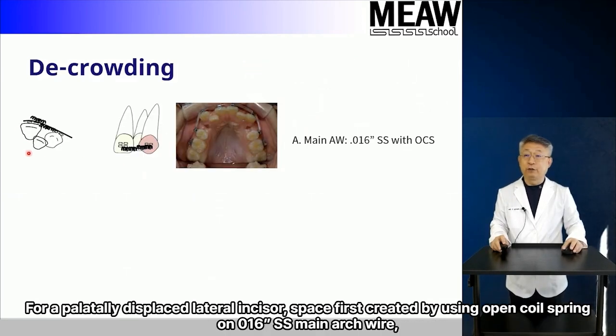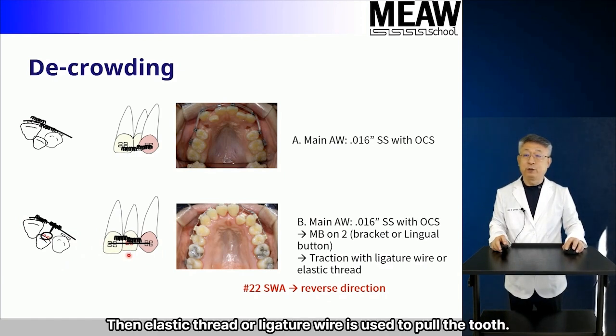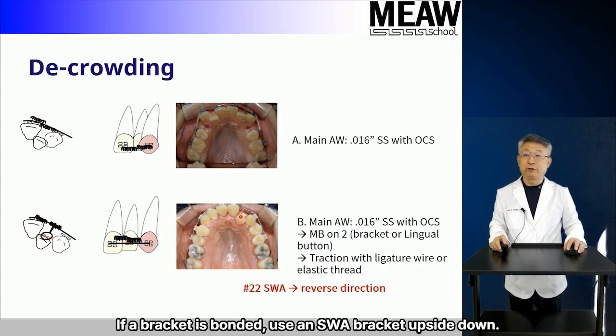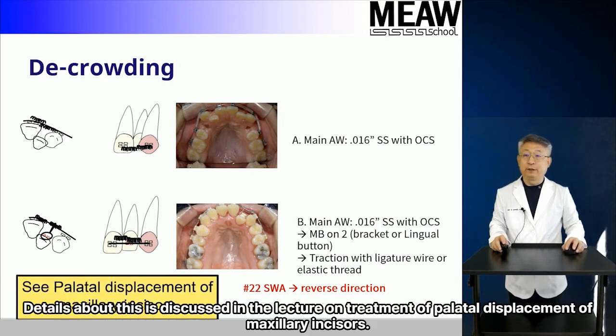For a palatally displaced lateral incisor, space is first created by using open coil spring on 016 SS main arch wire, before it is bonded with a bracket or a lingual button. Then, elastic thread or ligature wire is used to pull the tooth. If a bracket is bonded, use an SWA bracket upside down. Details about this are discussed in the lecture on treatment of palatal displacement of maxillary incisors.